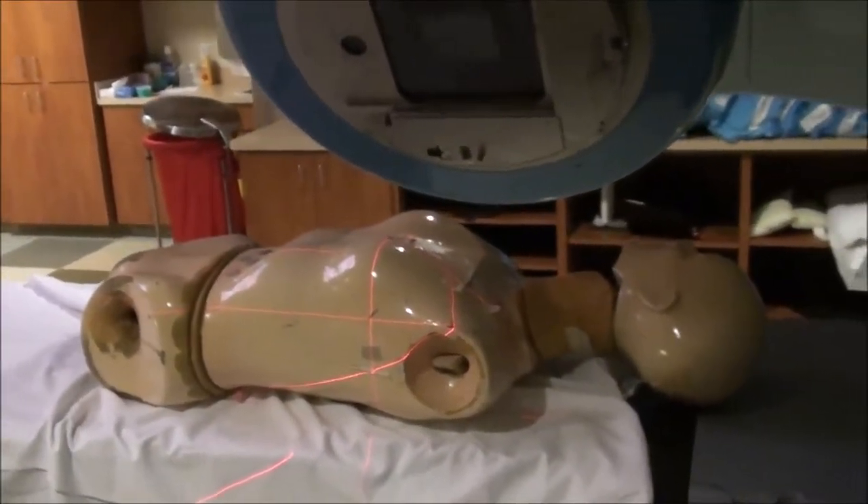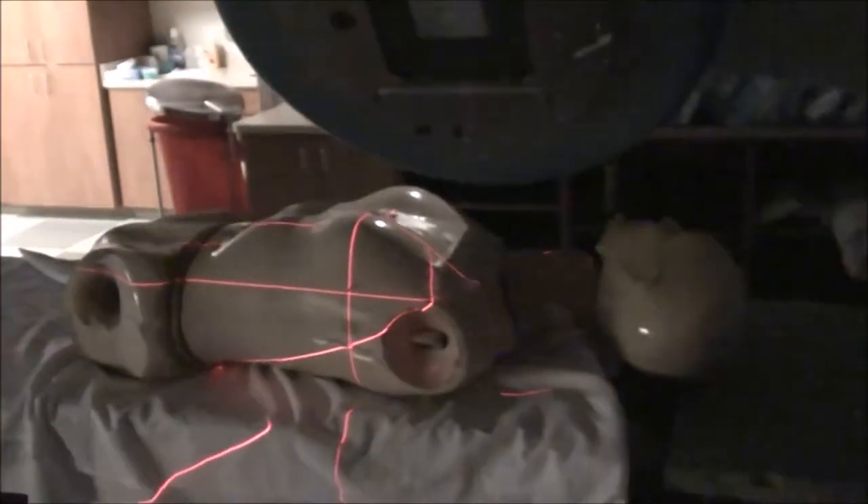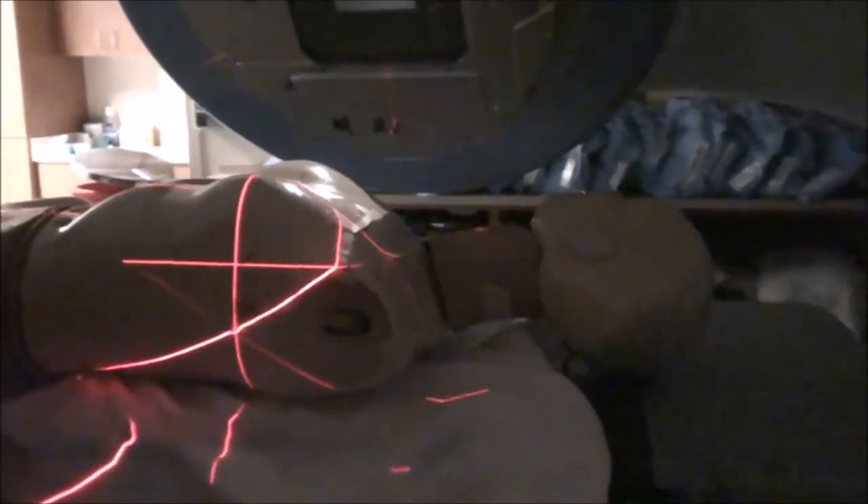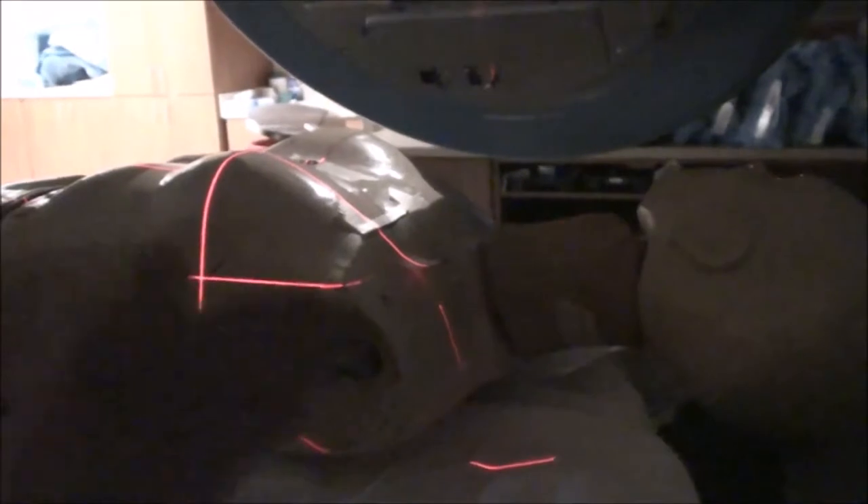Let me turn down the lights a little bit. You can eyeball where this wire is. You can see there's a little pie wedge of light right here — that is a hot spot. You can see there's a pie wedge of dark right here — that's a cold spot. What we're going to do is turn the table until we get rid of both of those. That table kick, just like what we talked about with head and neck except it's the other end, now has the superior divergence minimized to match the non-diverging beam from the AP supraclav. You're going to fluoroscope this and look at that wire and make sure that wire lays perfectly against the superior edge of your field.